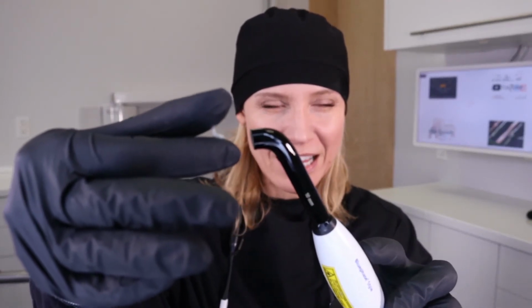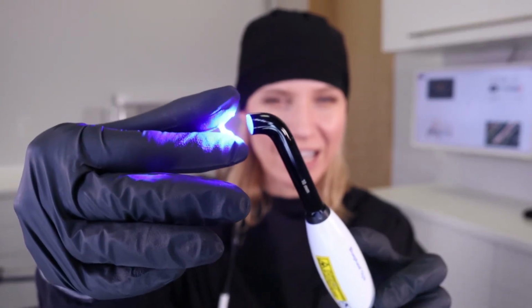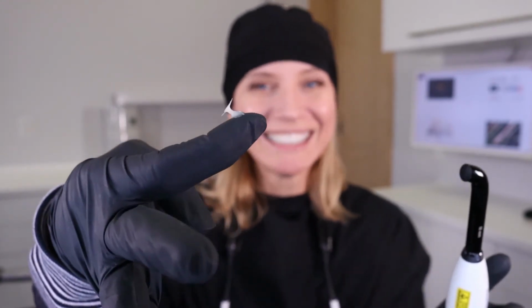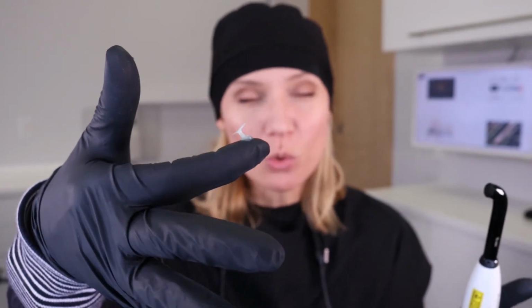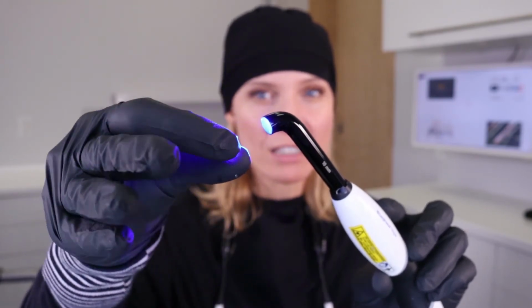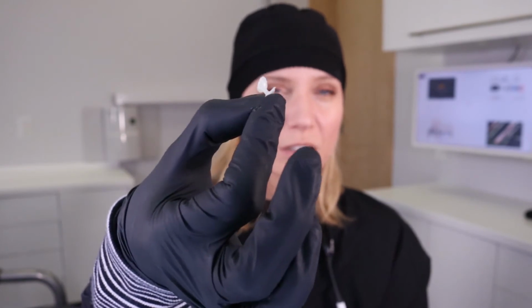So we've got that, but let's say we want to make that hard. We're gonna put the light on it, and give me one more second, and voila. It's any shape you want. This is so cool because we can make teeth a shape, and whatever shape I sculpted, then I will put this special light on it, right? And it stays hard. So now we've got, again, no one's tooth is gonna be this shape, but I have a shape that I can use for my tooth that is tooth colored and whatnot. And I can do the same thing with gums as well.